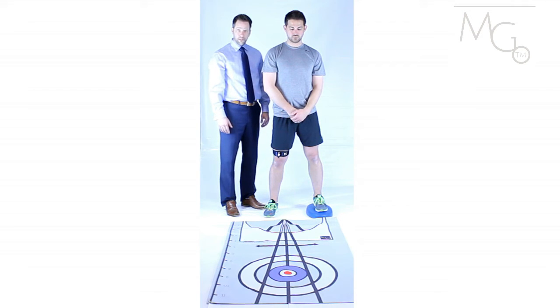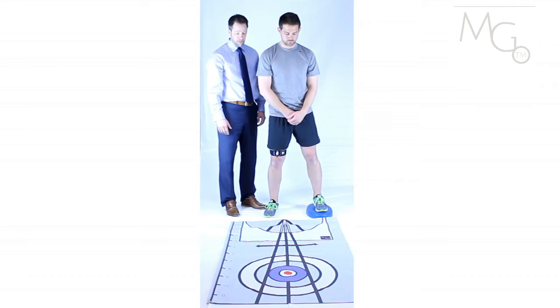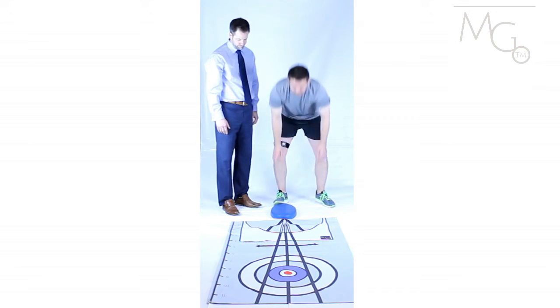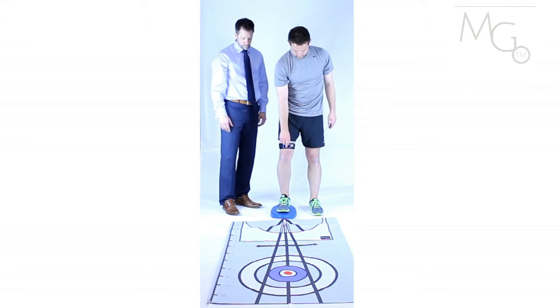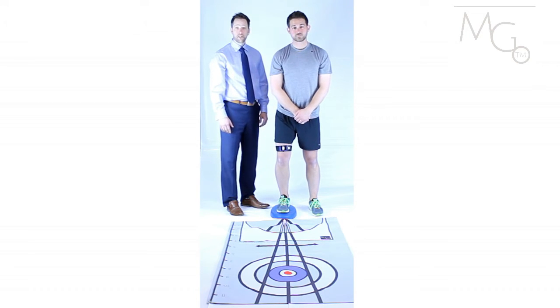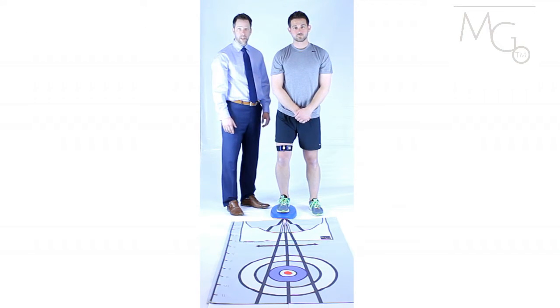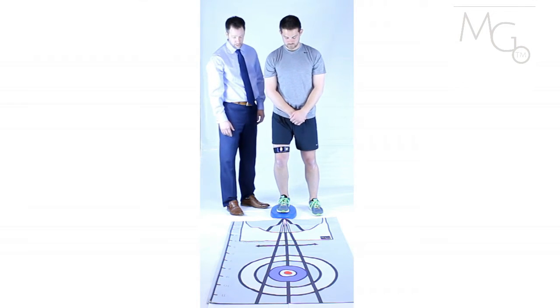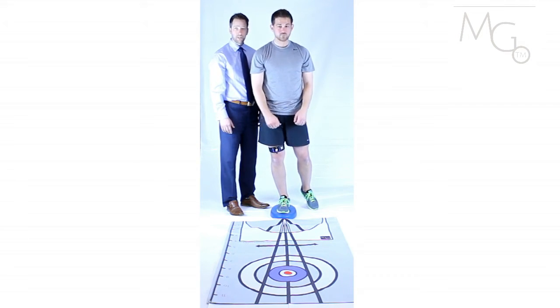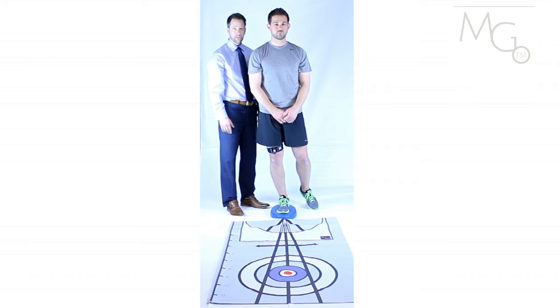We can also progress further by putting the soft surface underneath the involved side. The patient can then perform single leg squatting on the involved side while standing on the soft surface, which will promote more of a challenge for body balance and awareness.